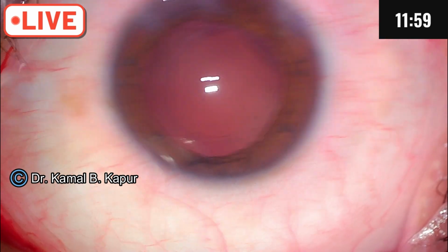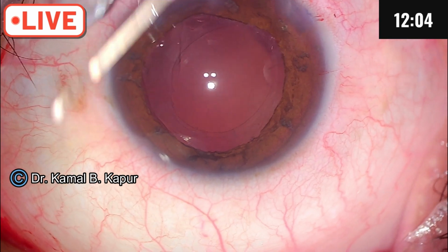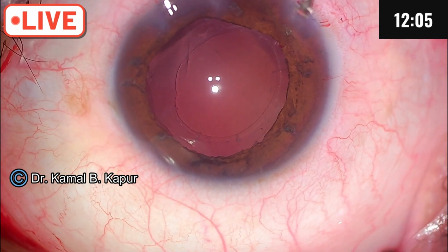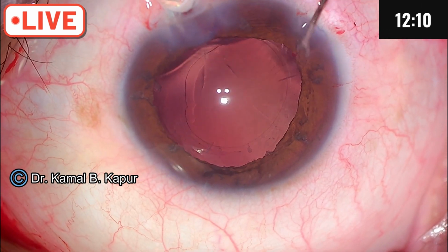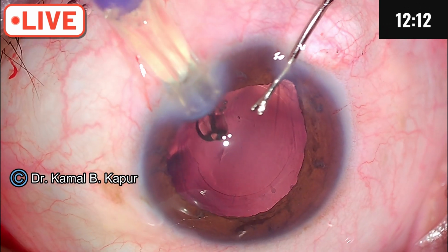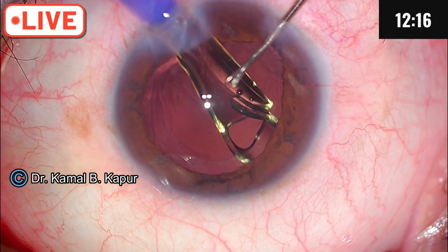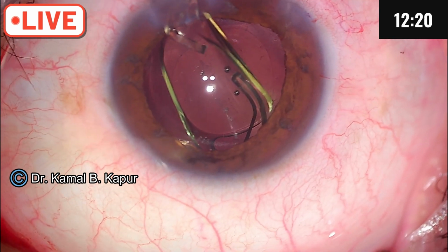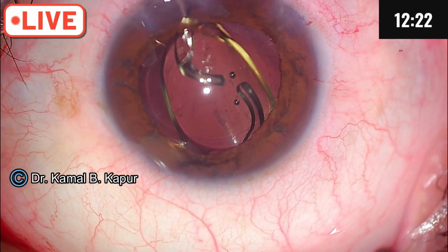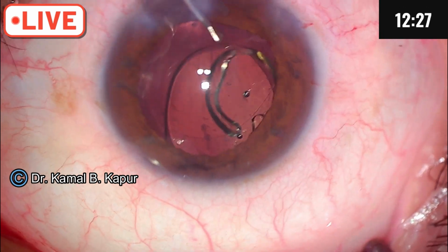So I would rather put the IOL. Now the angle of placement of IOL is always maximum part of the haptic should be facing the maximum area of subluxation. So we will introduce the IOL in the area of least subluxation and then slowly, that is the reason I shifted from the temporal incision to a superior incision.